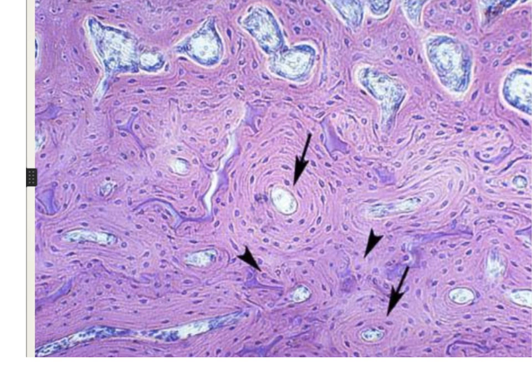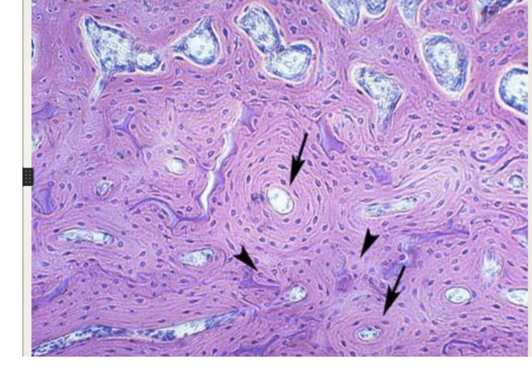This is a very nice picture. You can see the Haversian system here, and another Haversian system here. This Haversian system is formed of a Haversian blood vessel surrounded by concentric bony lamellae, and here we have the interstitial lamellae. Here we have the concentric bony lamellae, and the blue dots are the osteocytes in their lacunae, or osteocytes alone, because lacunae cannot be seen in this decalcified section.